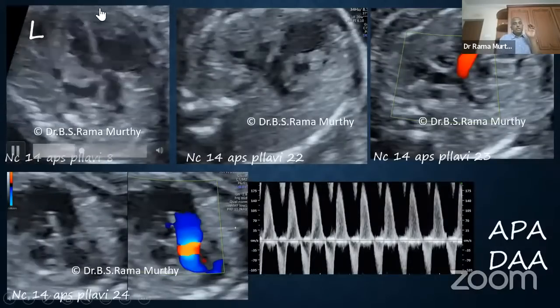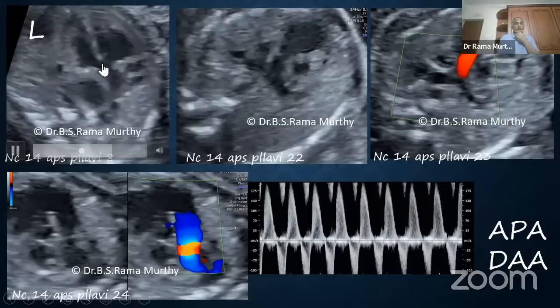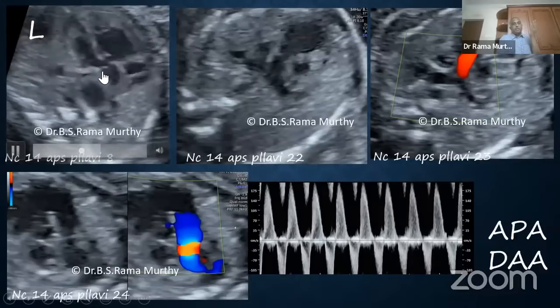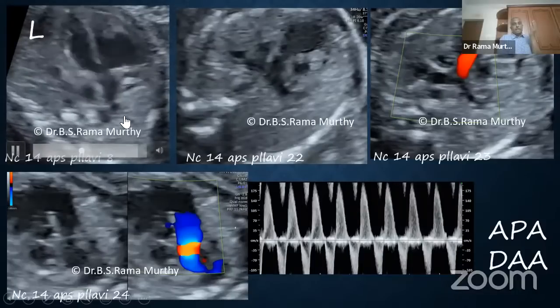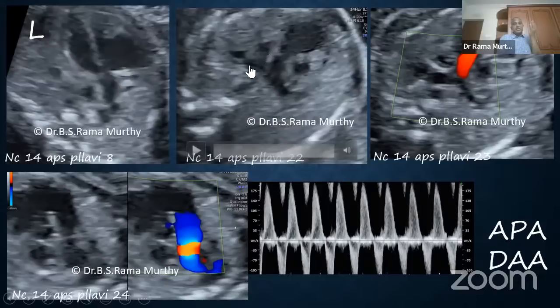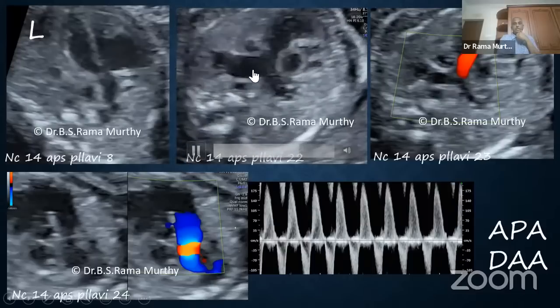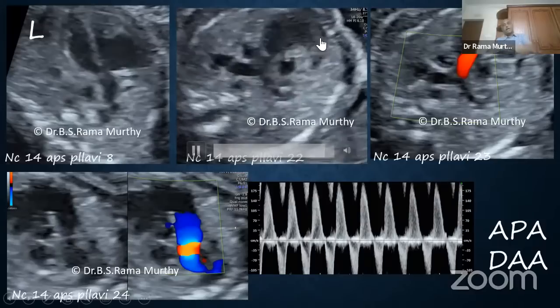And I want you to see this particular case. So the first thing is the 4-chamber view, and then quickly it goes into the LVOT. And in the LVOT, you have the all familiar pattern of the overriding artery, which looks quite big. Now, in this background, I need to look at the RVOT, and I'm doing the 3-vessel view version of the RVOT.